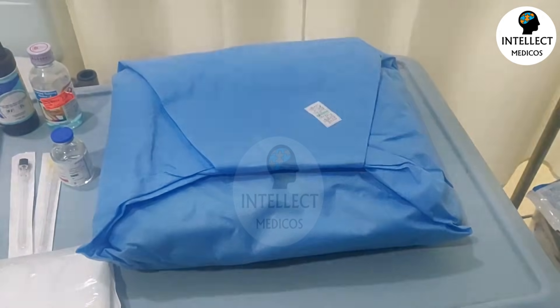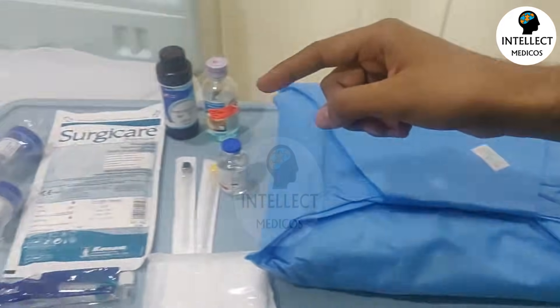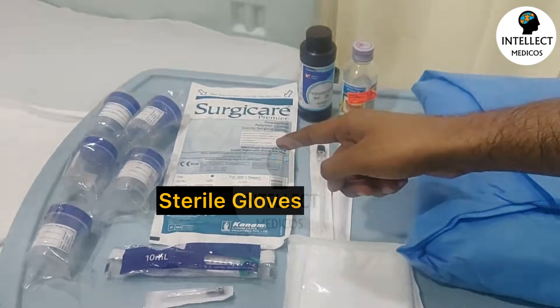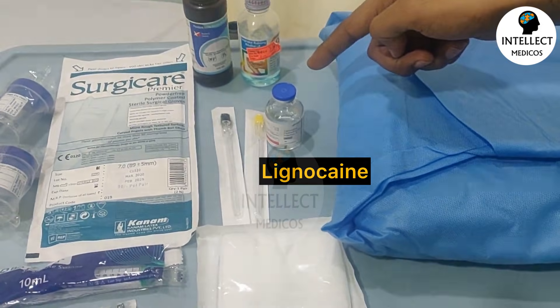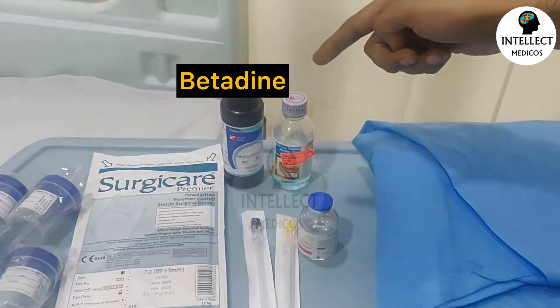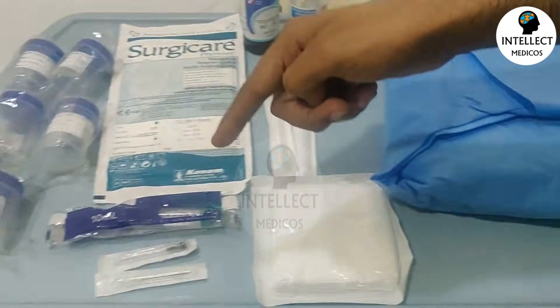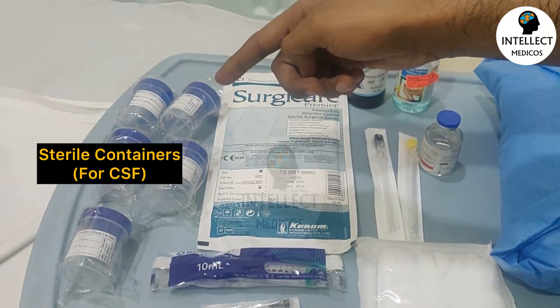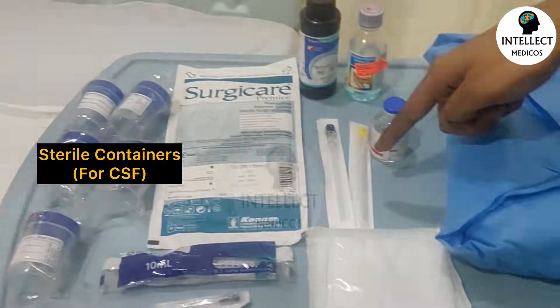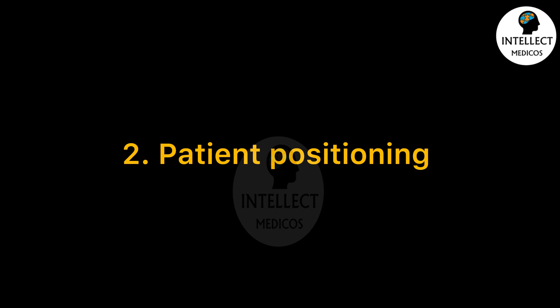Equipment needed includes a sterile set, sterile gloves, lignocaine solution, a disinfectant, syringes, containers for the fluid, and LP needles.